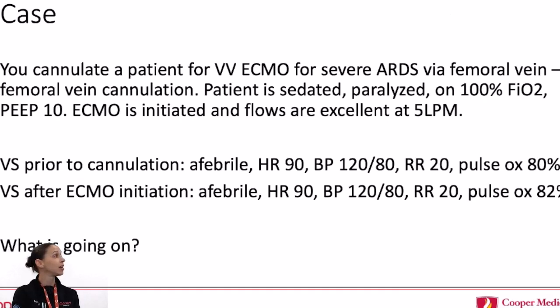Would you say? Cannula migrated? So yeah, indirectly. So what could happen if the cannula is migrated? There's a word to describe this phenomenon that I can show you on the next slide. Does anyone know what could be happening?